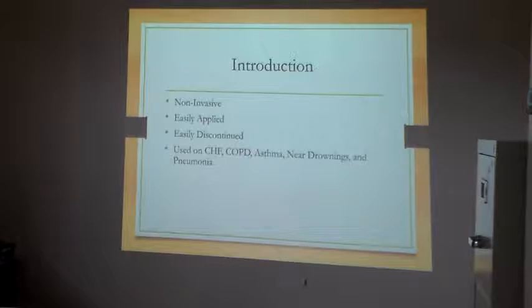Okay? We can use it on CHF. This is a big change because it used to be we only used it in CHF. That was it. Now we use it on COPD patients. And remember, our COPD patients are asthma, emphysema, bronchitis, bronchiolitis, and pneumonia. We use it on asthma patients. We use it in near drownings.